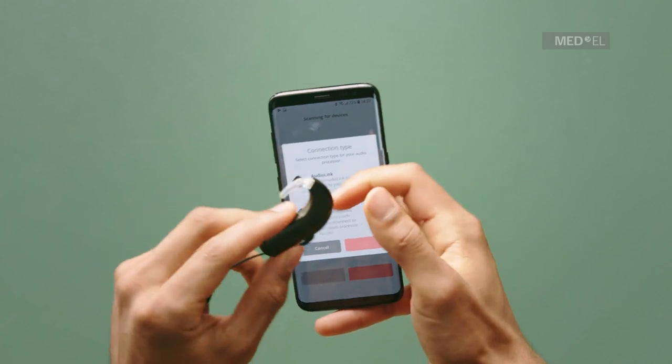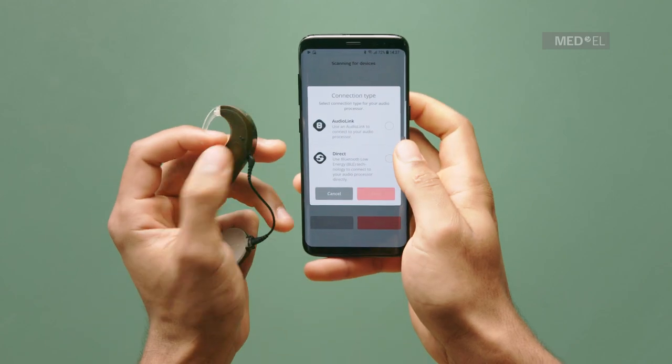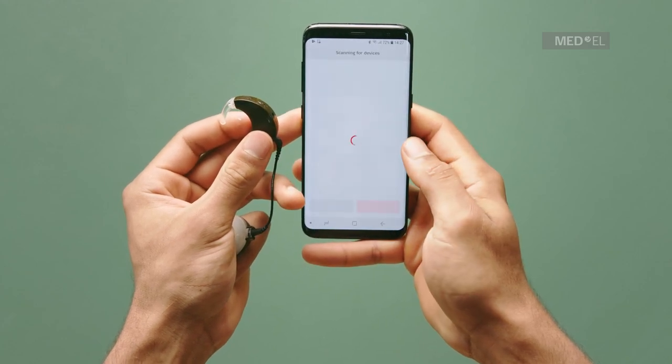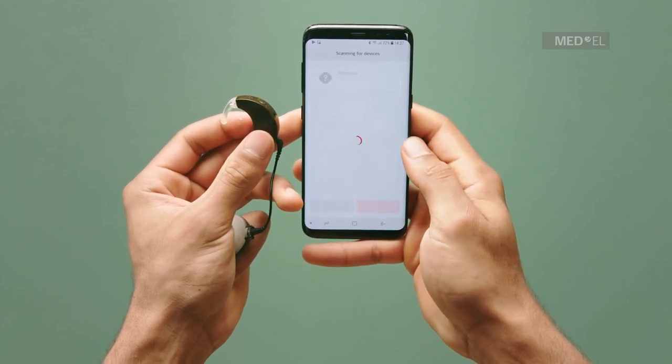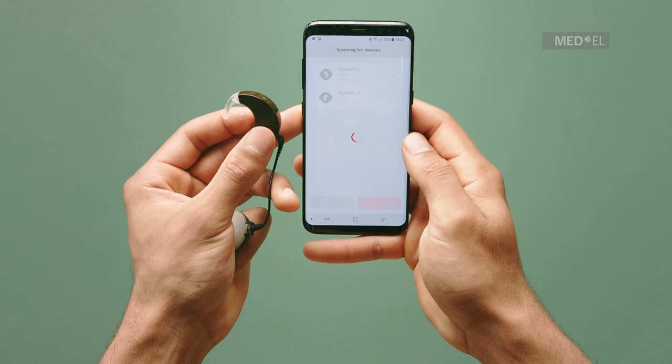The first generation Sonnet Audio Processor pairs to AudioKey via AudioLink. Sonnet 2 can be connected directly. If you are pairing via AudioLink, make sure AudioLink is switched on and is paired with both your audio processor and your phone.